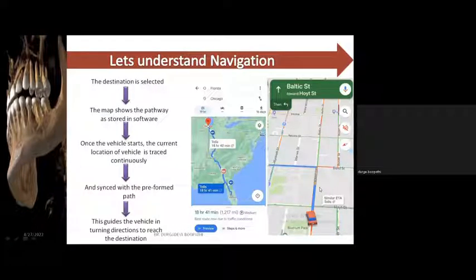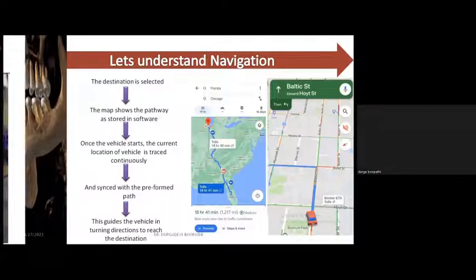Consider this is given for a surgery, especially consider it for a dental implant where the ridge is very, very less and it's near to the nerve canal. How beautiful and how awesome it will be. Like everything is given to you. You just have to do it in the right way. This is the concept that is present in surgical navigation and software computer assisted navigation.